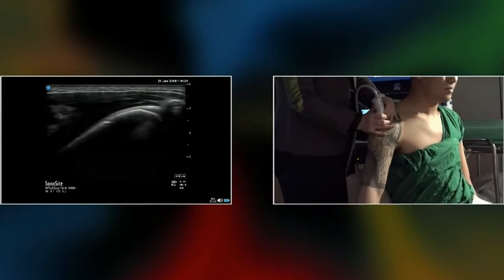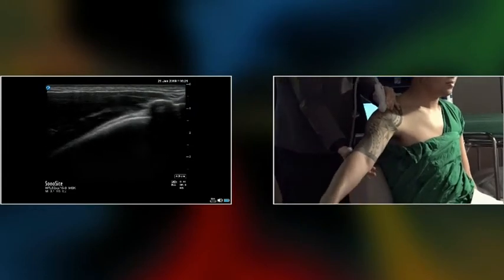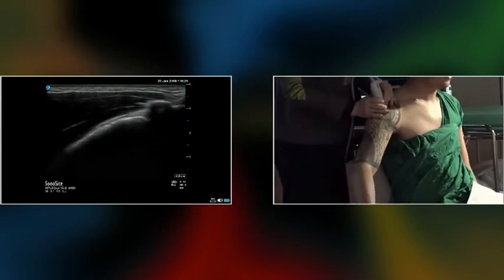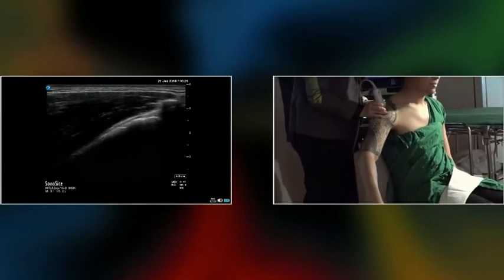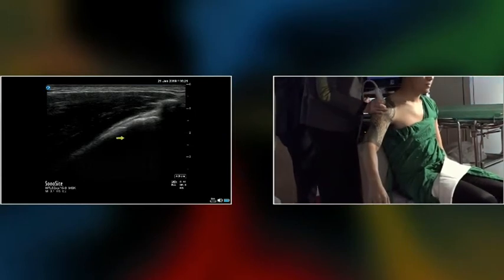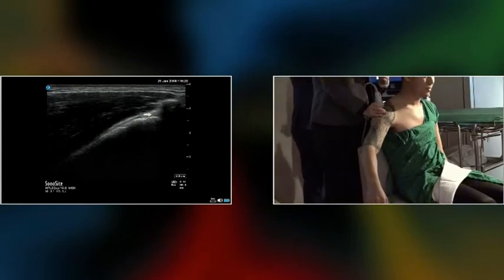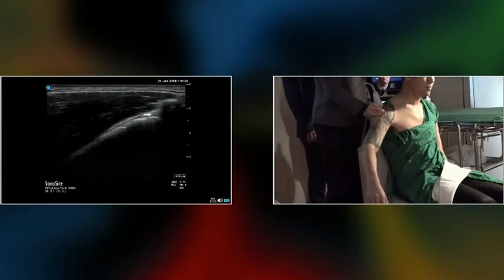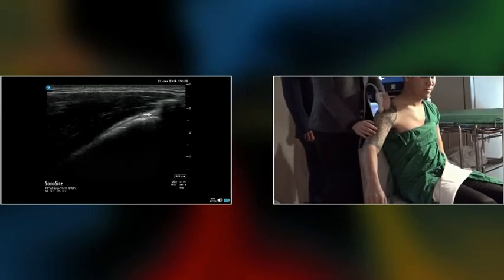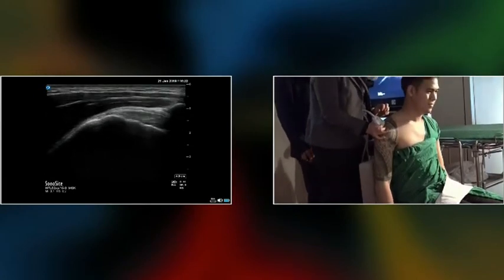Okay, so if anyone has a painful arch or any subacromial impingement up to this point, you will see the thickening around this area, or with bursitis, or repetitive bursitis, calcifications, thickening. Then the middle-aged lady or man will have pain up to that point. Okay, so you see he is very, very good and he didn't have any problem.